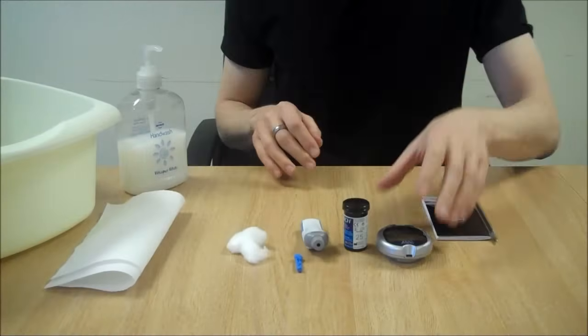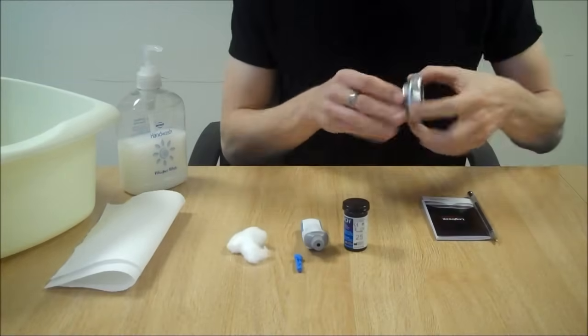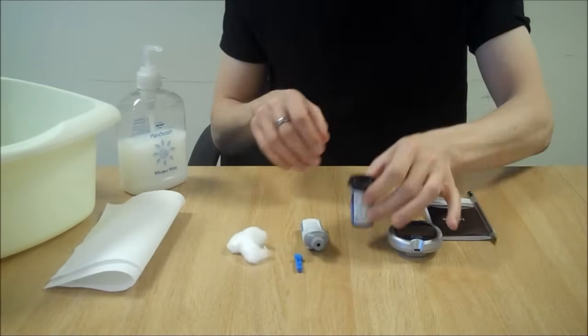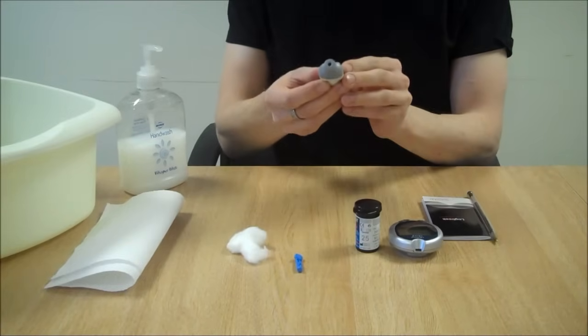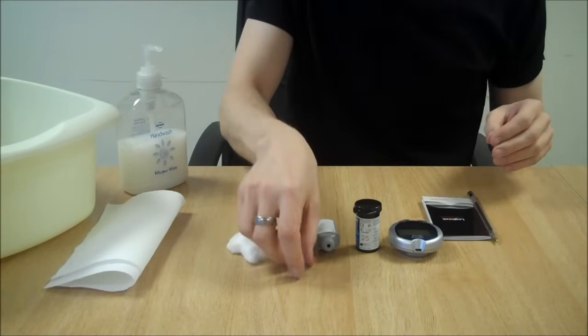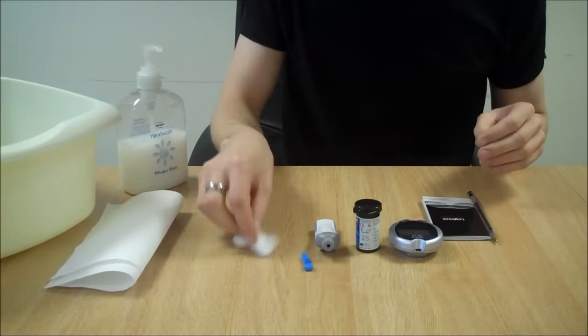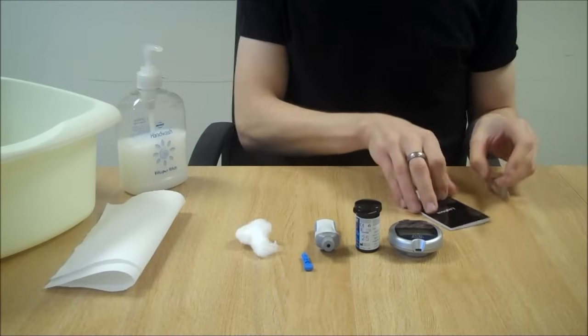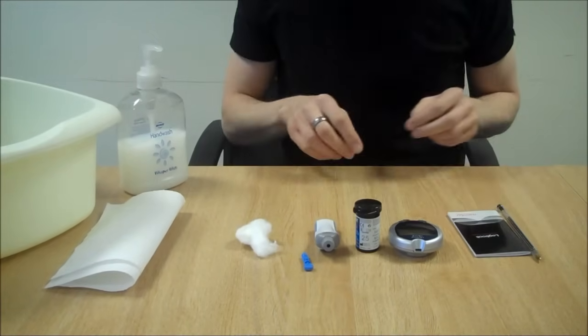Prepare your kit. You will need a meter, test strips, a finger pricker or lancing device, a lancet, cotton wool, and a monitoring diary to record the results.